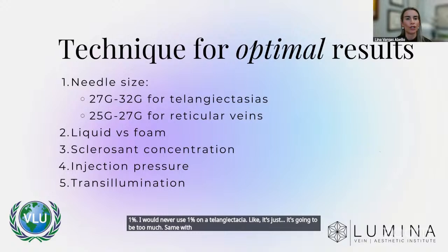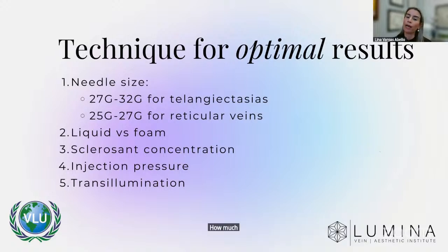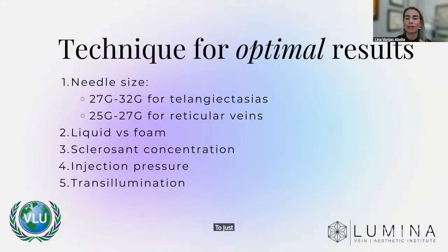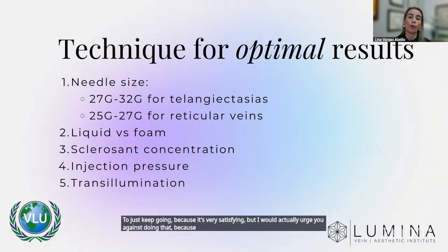Same with my pressure of injection. And this is something that actually comes with experience, because there's no way that I'm going to be able to measure and tell you how much pressure I'm applying when I'm injecting. But if you think about it, it's very tempting when you're injecting and everything is clearing out to just keep going, because it's very satisfying. But I would actually urge you against doing that, because you are putting more and more pressure. Remember, when this sclerosant goes inside, it's going to lead to venous spasm, vein contraction, and that is going to increase your pressure. So you're going to have to put more pressure for that sclerosant to keep clearing that lesion.